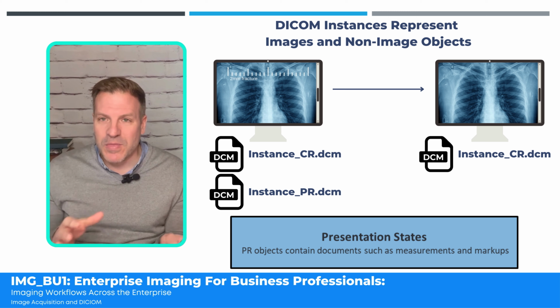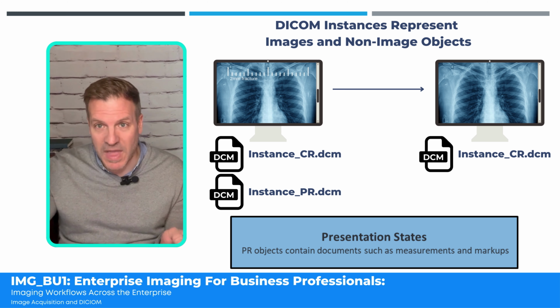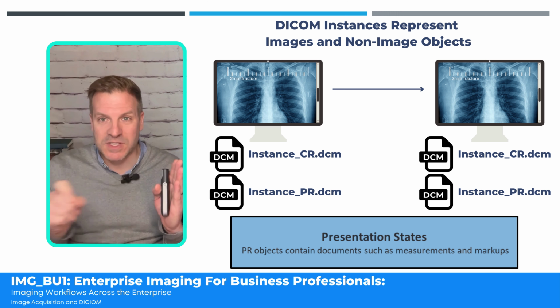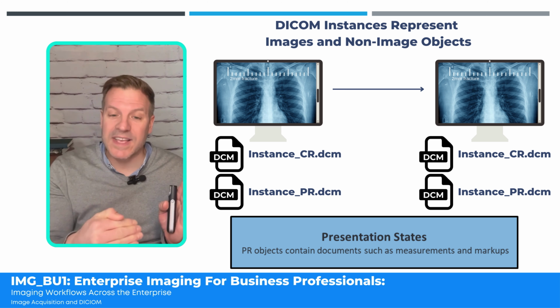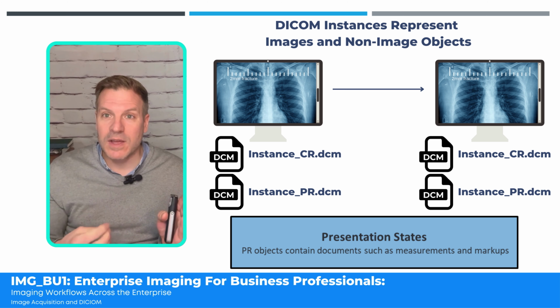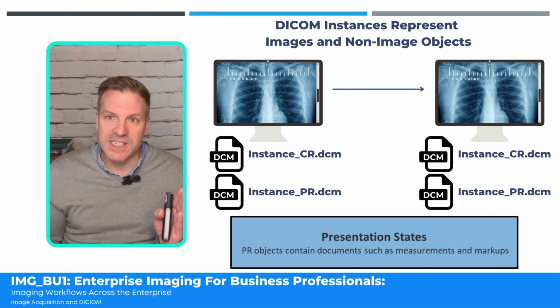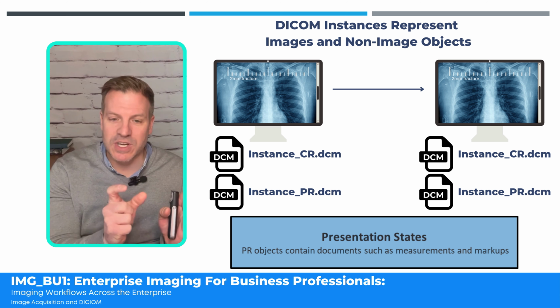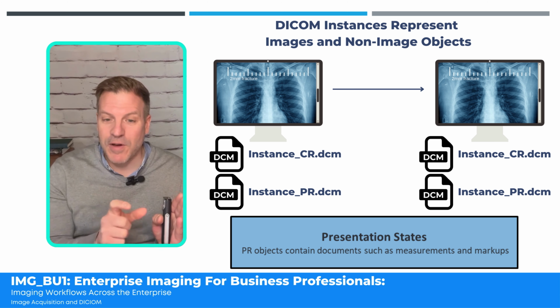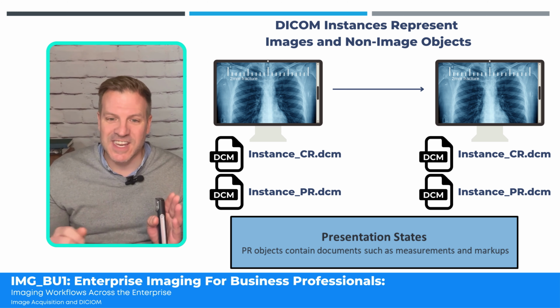And we have these presentation states where I can have the image itself, and I'm applying markups and so on. As I'm creating my rulers and my markups, I'm going to be generating additional presentation states that reference this image. They are not an image themselves. They would be identified as a presentation state.